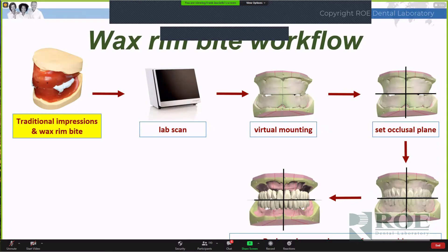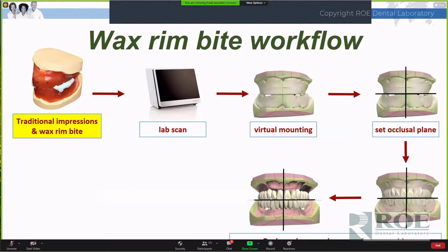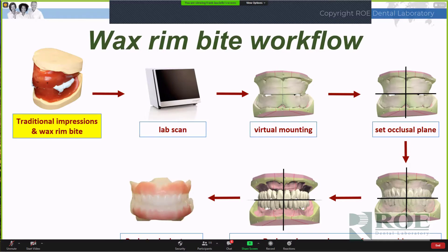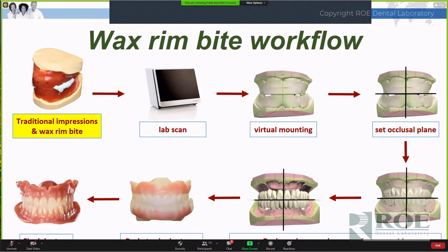A lot of things are captured from this wax rim and translated into the process of setting teeth. We can ghost in the wax rim at any time while positioning the teeth and make corrections accordingly — assuming the wax rim is where you want the teeth to be. For example, I recently called a colleague who had done a wax rim bite, and I wasn't sure they wanted the teeth as far forward as the rim indicated. We looked at it together and it was a little far forward — so it's a great point of reference and easy communication. We then do a try-in, in this case a resin try-in, and then to a final denture.